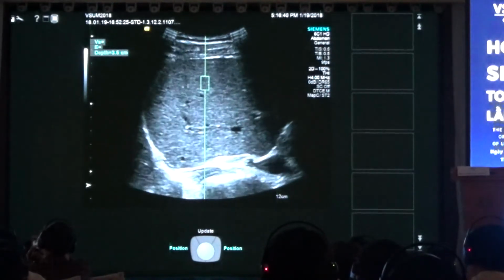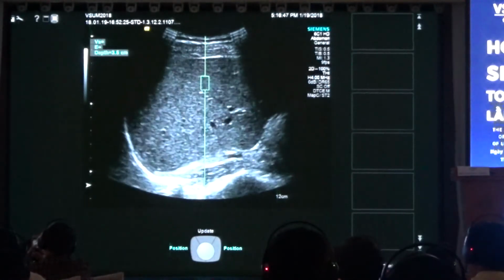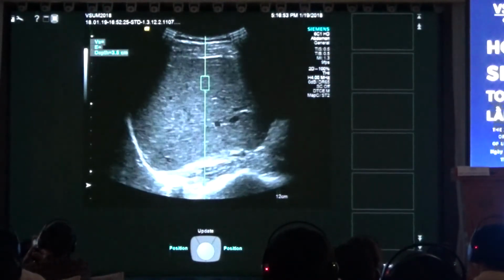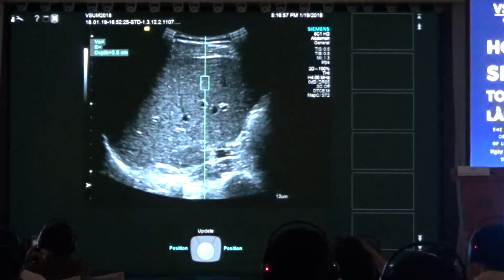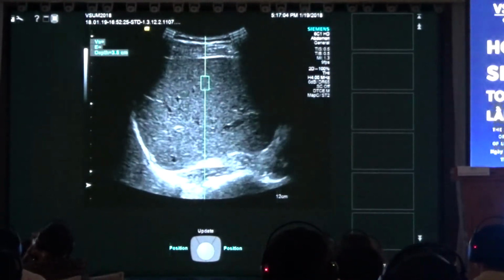And 2 take-home messages we have to recall. Don't go for the first centimeter of the liver, and don't go beyond 6 centimeters of the liver. In the first centimeter, you will get too high values, and due to attenuation in the distal part, you get too low values.